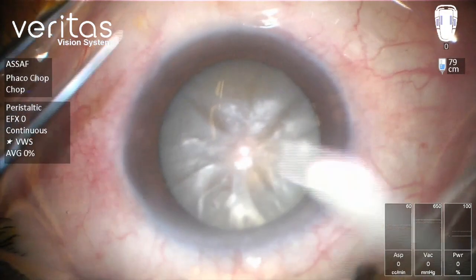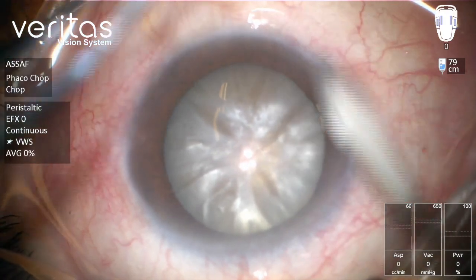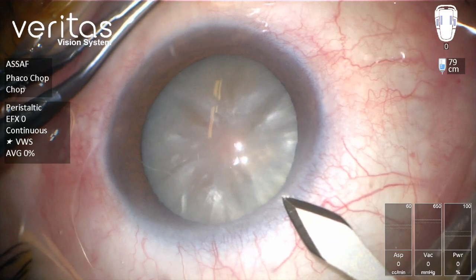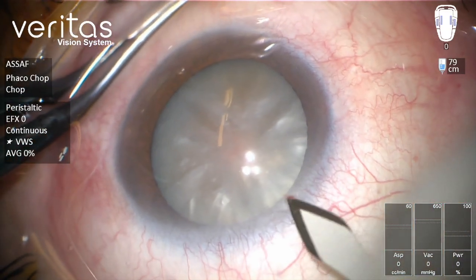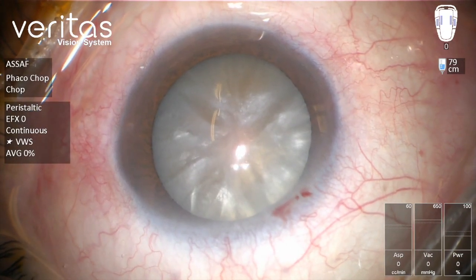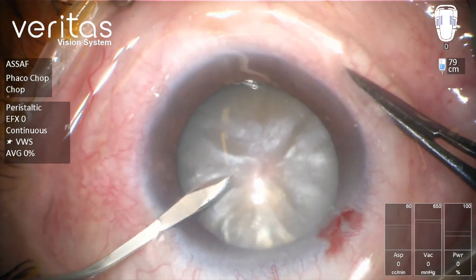This is a routine phacoemulsification for dense white cataract — as you can see it's a hypermature cataract. We'll start by creating the main incision, which is a 2.2 millimeter uniplanar incision, and this is the side port.